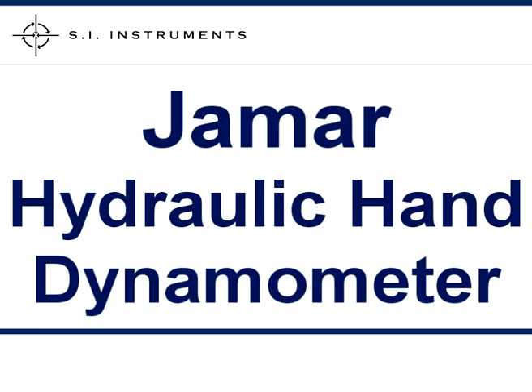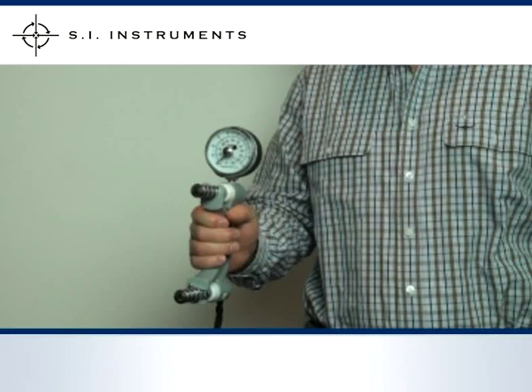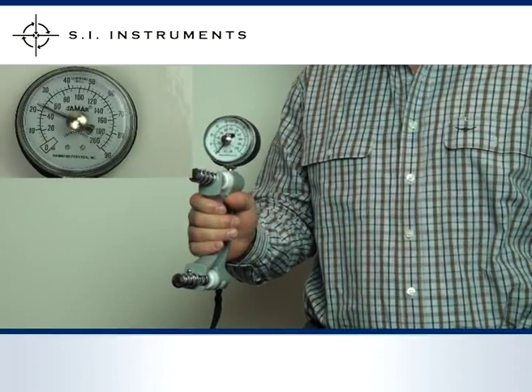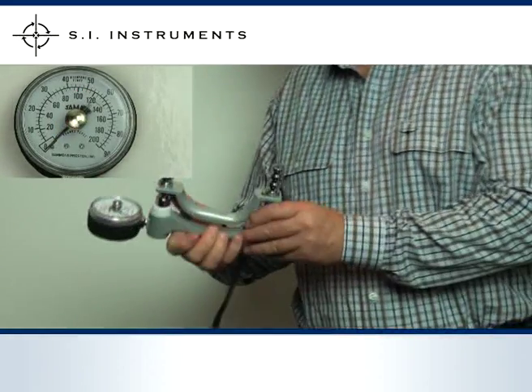The Jamar Hydraulic Hand Dynamometer features simple result readouts in both pounds and kilograms. To operate the dynamometer, first set the adjustable handle to the spacing required and ensure the peak hold needle is set at zero. Then squeeze the dynamometer with maximum strength. The peak hold needle will automatically retain the highest reading, allowing you to note the measurement before manually resetting the dynamometer.